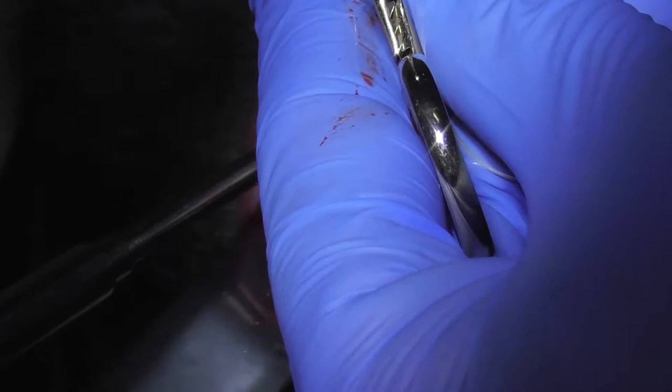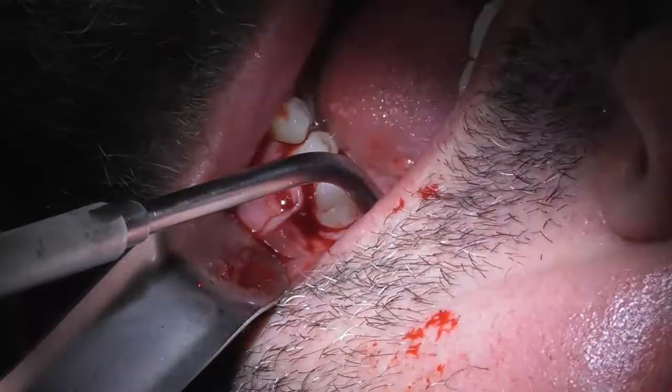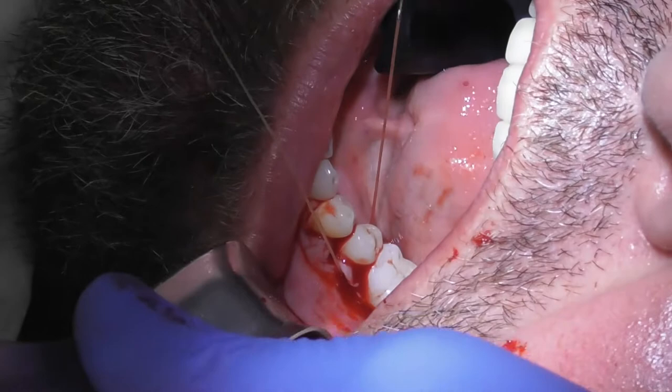You can see that I went over the top of the tooth in the interproximal contact, which really helps hold that suture right where it needs to be. There will be extra tissue as you can imagine, because there was that little balloon of bone in there and that's now gone. That extra tissue will tighten up — we don't try to cut anything away because we want to preserve the keratinized tissue, the stuff that's right next to the teeth.